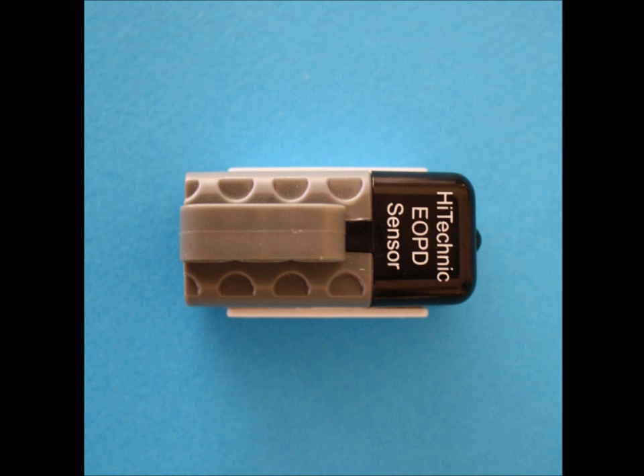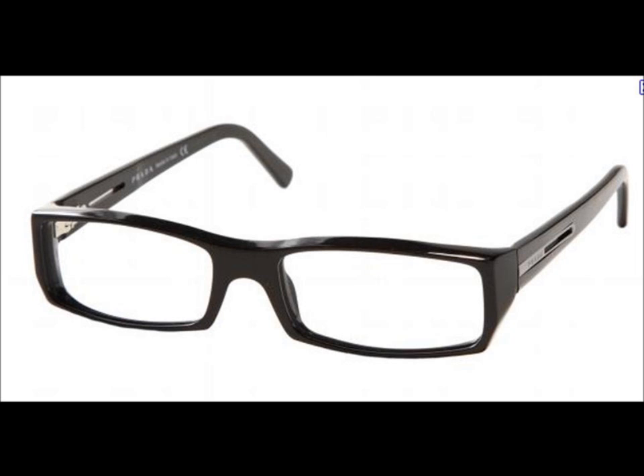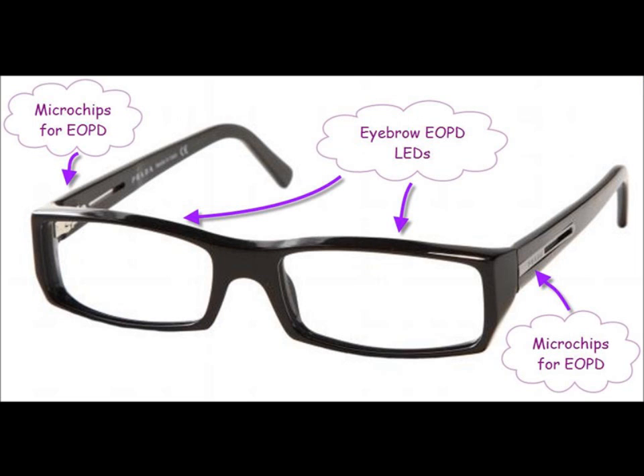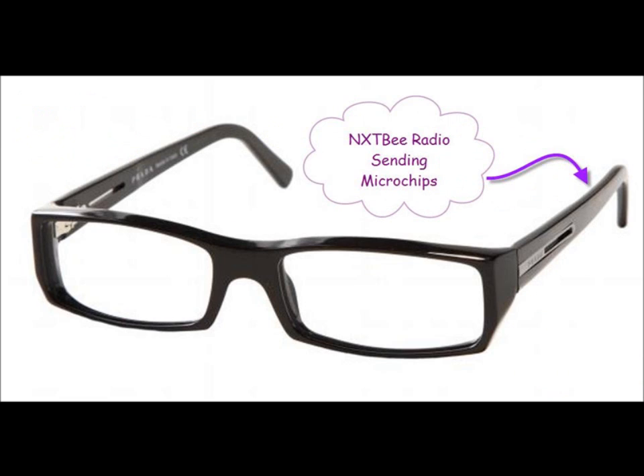While Lego sensors can be big and clumsy, the electronic components inside are only a few millimeters thick, and can easily be built into a pair of thick-rimmed glasses. Eyebrow sensors here. Ear sensors here. NXT radio here.